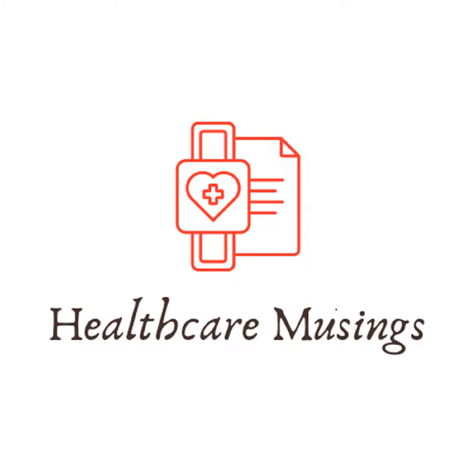So the referring physician, I don't want to disparage any colleagues, but the referring physician insists on having SIMV, so I can keep them on SIMV mode, but I can just dial up the pressure support to make it act like assist control. But we don't use this mode because in the operating room, it's like assist control. So pick. Either you want pressure support or you want assist control. SIMV belongs in coffee. It does not belong in the ICU.